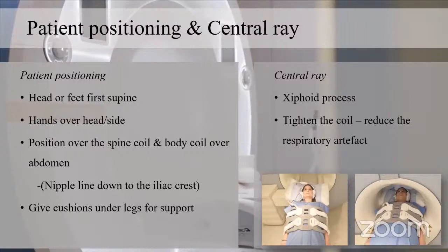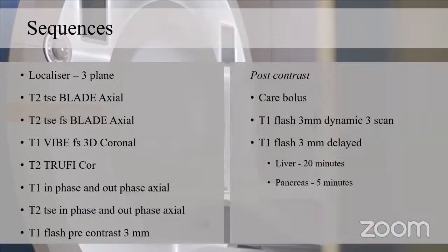And the central ray is the xiphoid process. I will center over the xiphoid process and tighten the coil. Now we'll move to the sequences.